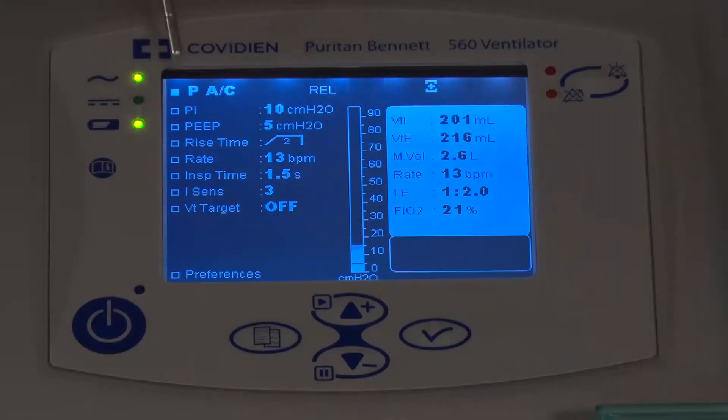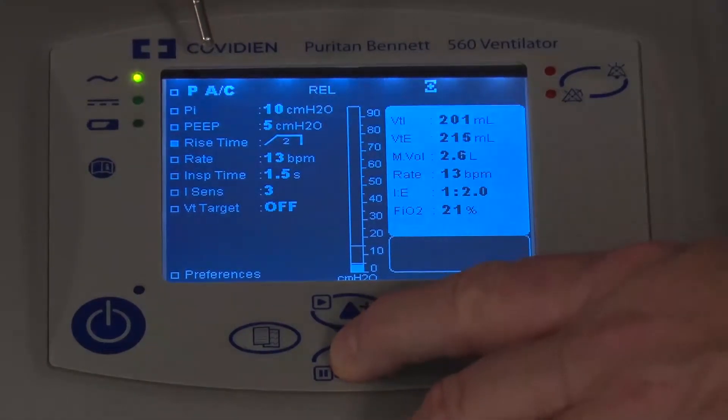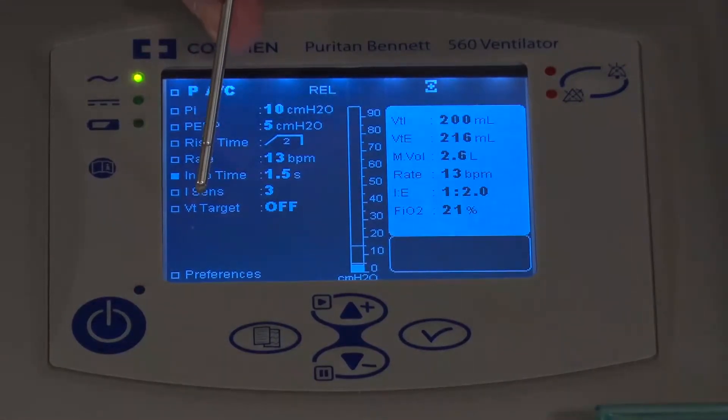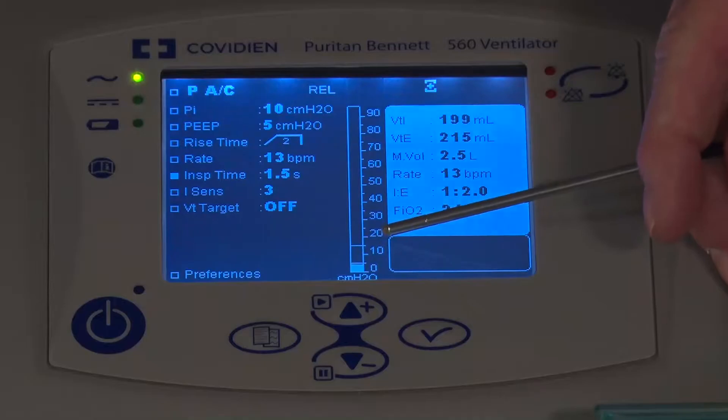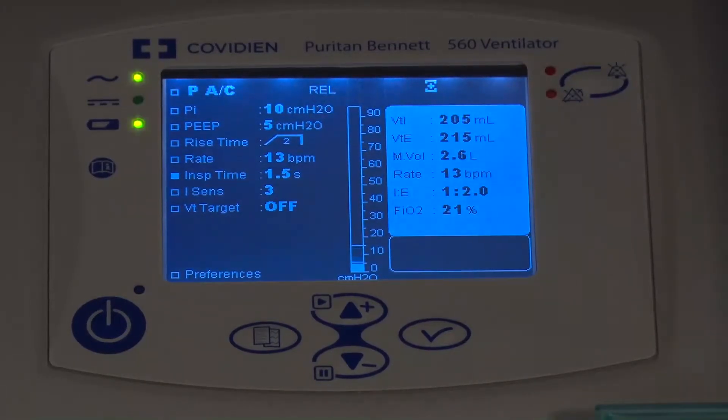As we look at the rest of the pressure control parameters, you have rise time, rate, and inspiratory time. Like all modes, verify all settings on this screen and then go down to the preference screen to confirm everything is set the way you want. On the screen there's also a pressure bar showing pressure rise from PEEP up to peak pressure. You can also see patient parameters: inspired and expired volumes, minute volume, total respiratory rate, I:E ratio, FiO2, and an active exhalation valve indicator for the dual limb circuit.